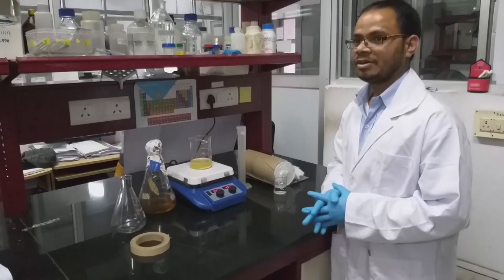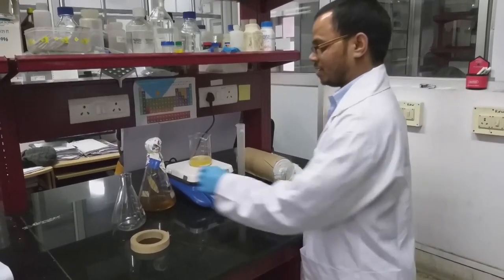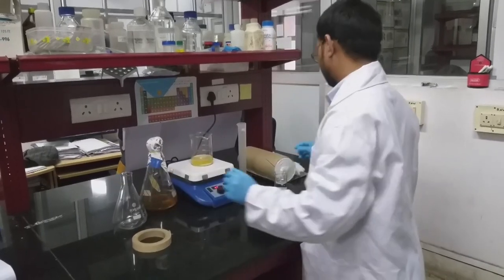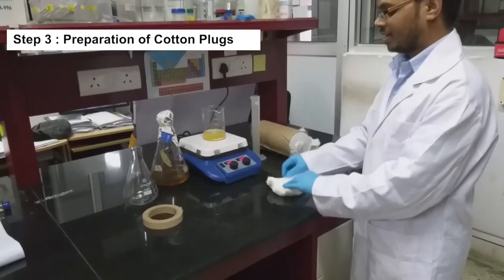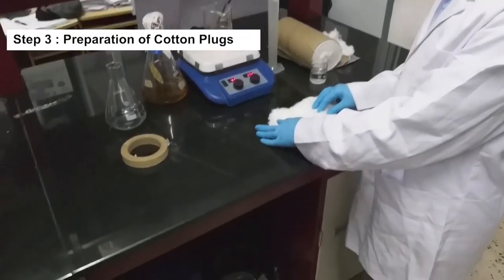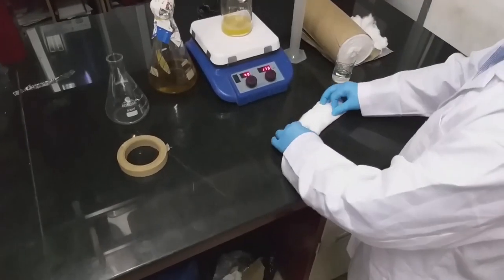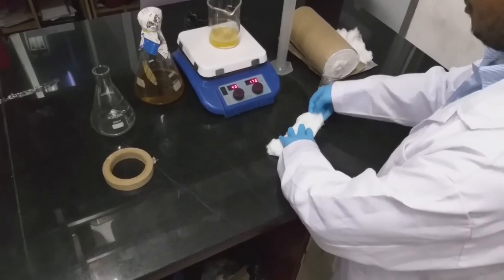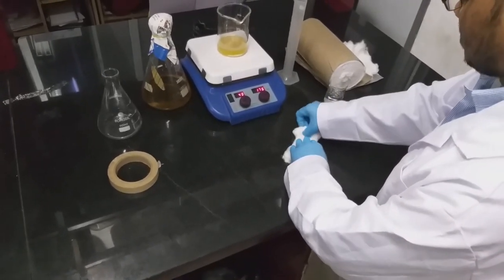While it is steaming, we have to prepare a cotton plug for the flask. For preparing the cotton plug, you have to take one thick sheet of cotton. With your two hands, fold it like this.